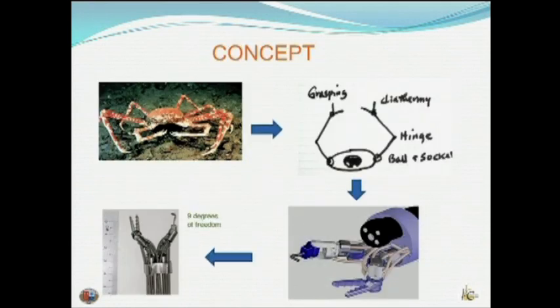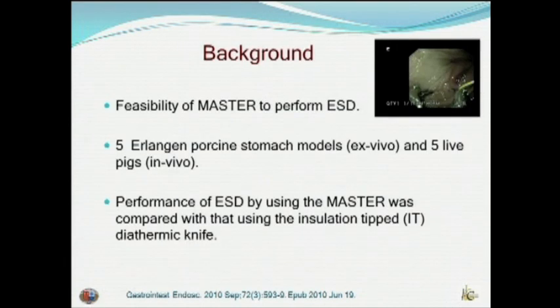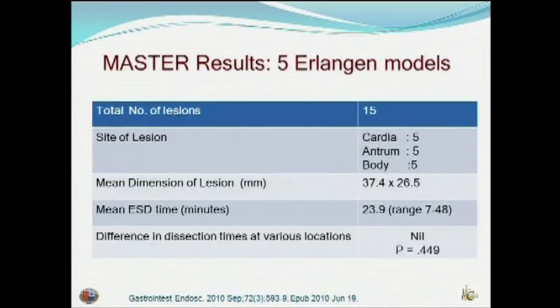We got our concept from the chili crab, which has two arms. One is the grasping arm, and another is the monopolar diathermy hook, which we translated into our robot, which has 9 degrees of freedom. Initially, we did a feasibility study on pigs with our master robot. We selected 5 Erlangen porcine models and 5 live pigs, and we compared the performance of ESD in live pigs with a standard IT diathermic knife.